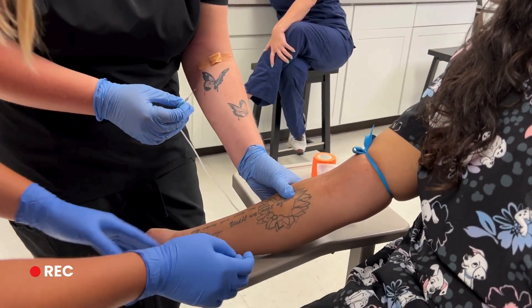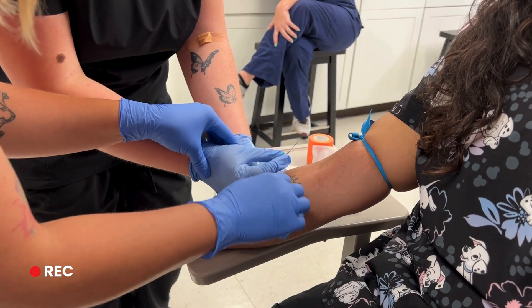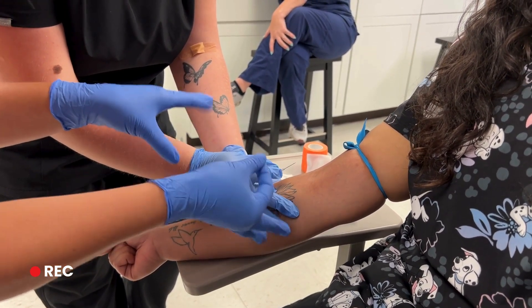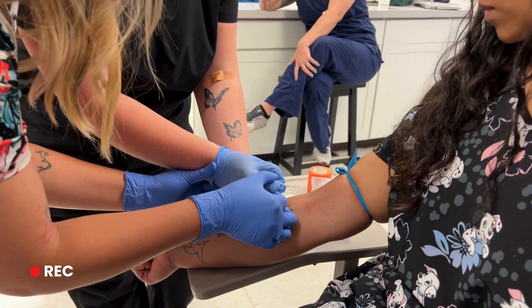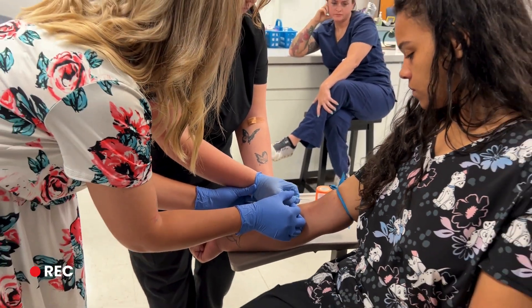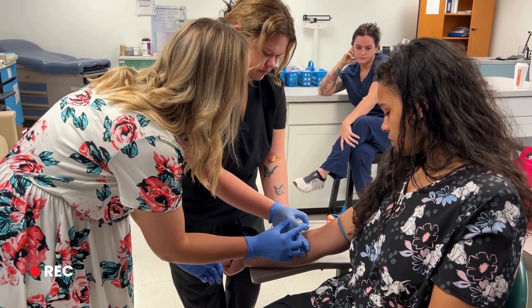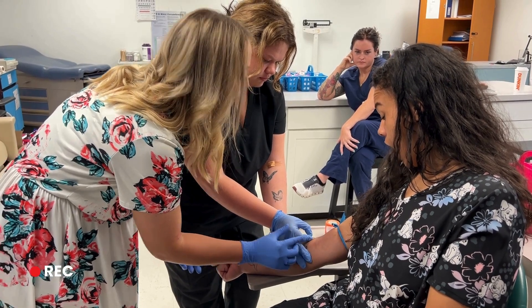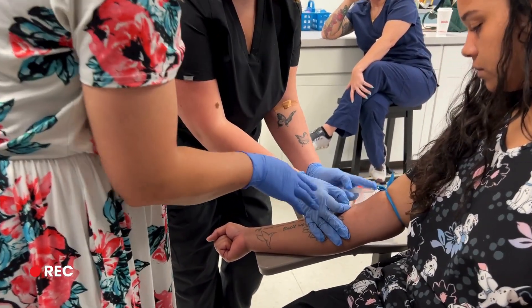It's different for everybody, but I use these fingers over here just to kind of guide my hand and get some support. Got it? Your flash — don't let go. There you go.